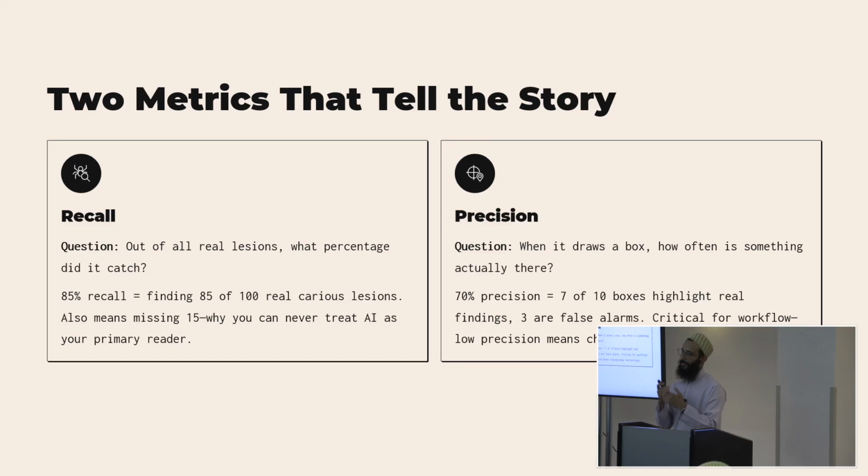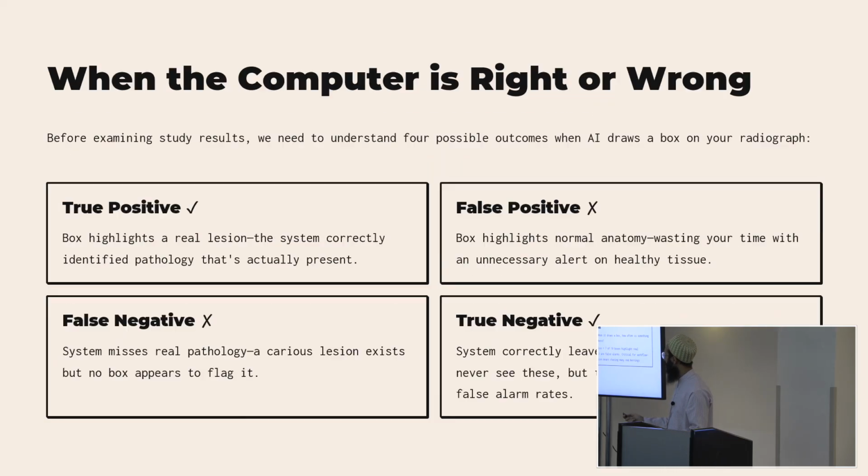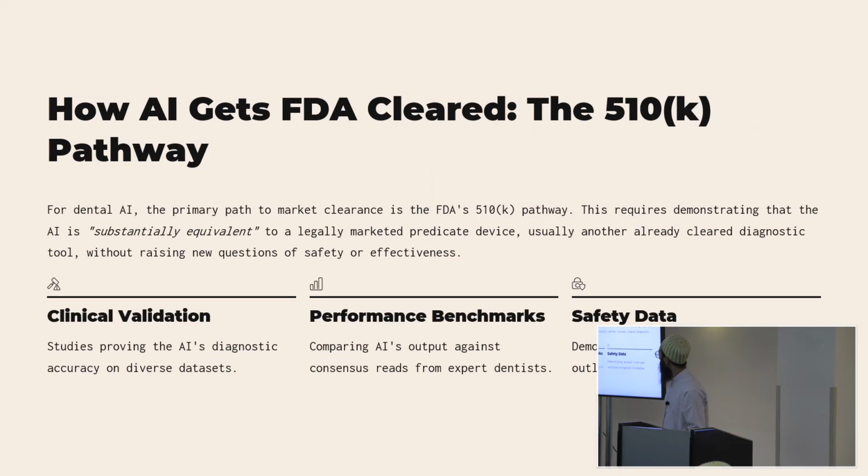You do this every day as a dentist when you read a radiograph, right? You make a call like, oh, I'm pretty sure there's something there, versus maybe it's not. But basically what we had to do is quantify that, and then justify to the FDA that where we're drawing our lines is good enough such that it doesn't make the dentist worse. It actually does help. And so with that, let's get into the clinical trial a little bit. We'll go into that right now.